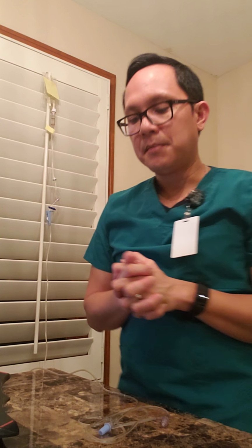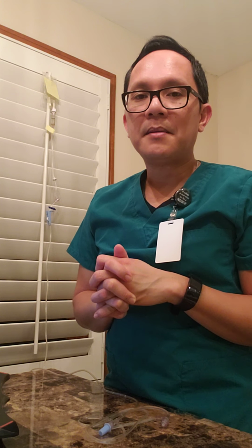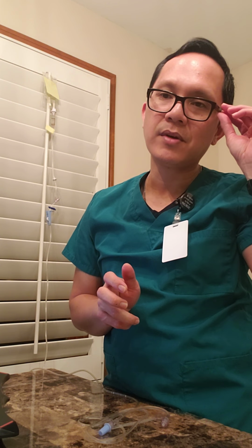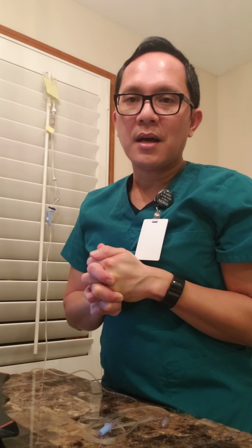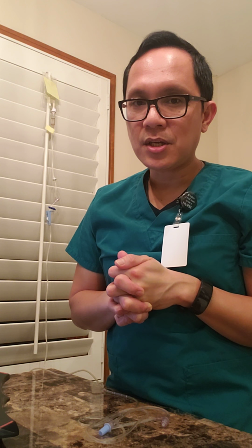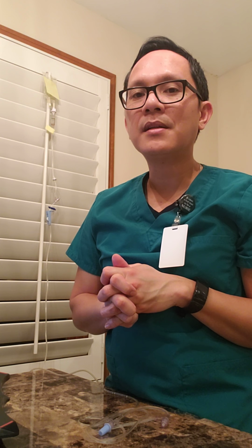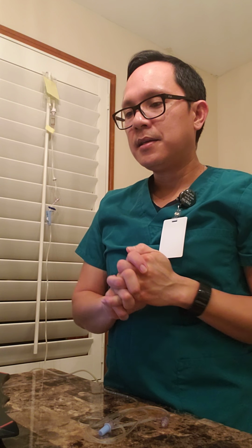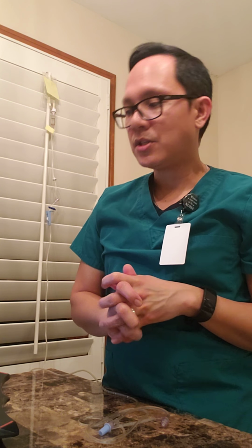I'm gonna of course introduce myself to my patient, and I'm gonna educate her about the medication that she's going to be getting, asking her if she has any questions, any allergies or any concerns, or if she wants to get the medication. If she refuses, she has the right to refuse it. I'm just going to document the refusal in the nursing notes later after I'm done. I also want to make sure I assess and evaluate my patient before and after I give the medication.